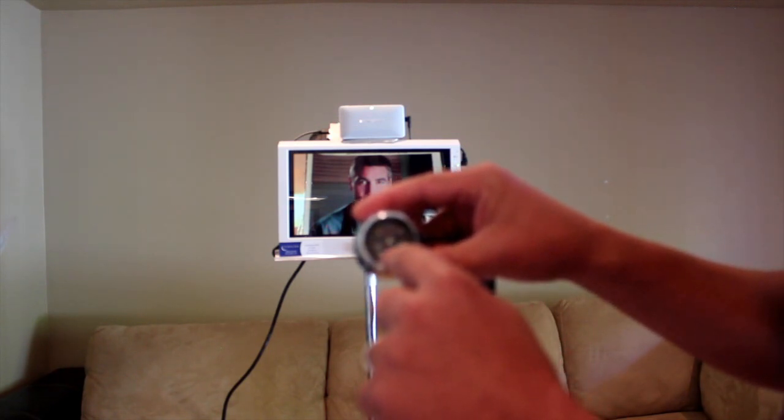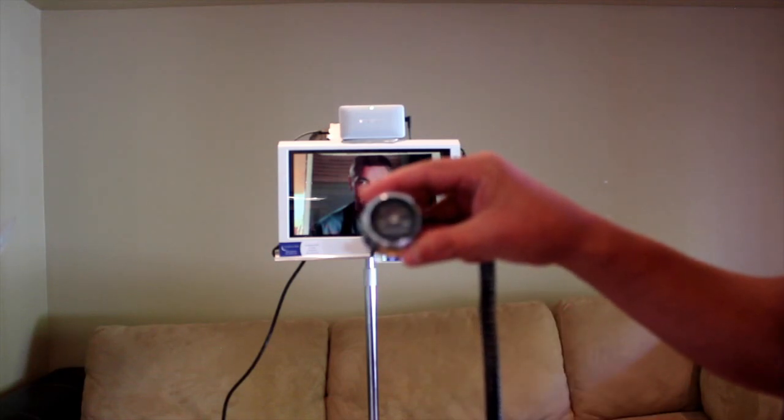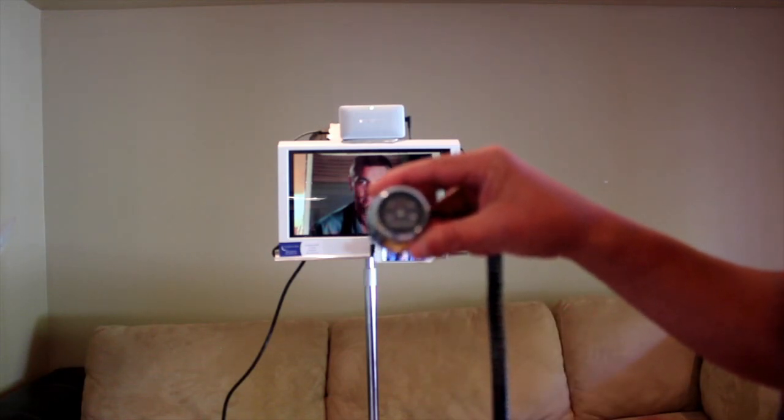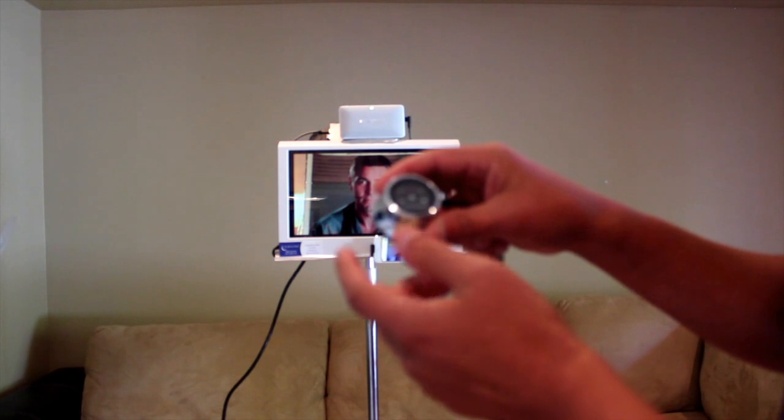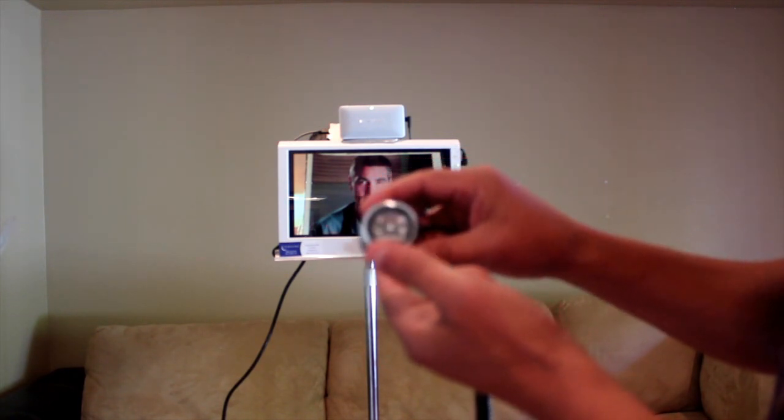Here is the digital stethoscope. It has a dial — the bottom dial shows the volume from 0 to 10. The top shows the frequencies that you're going to be able to listen to with the stethoscope. I like to turn mine on using the button next to the 0, just like so.